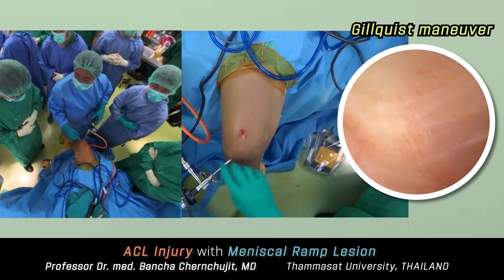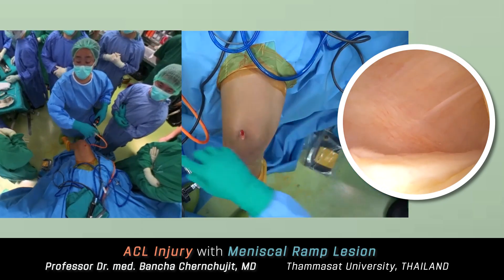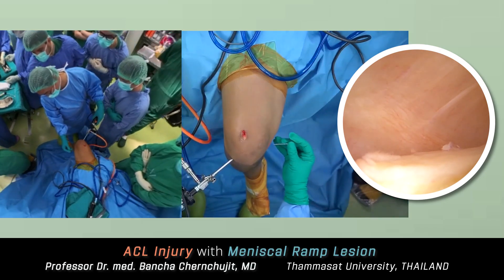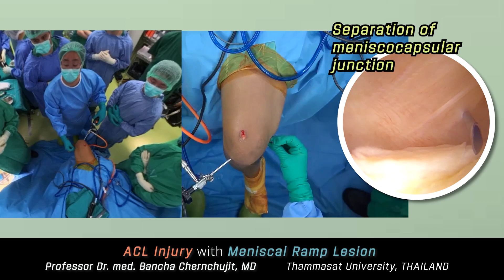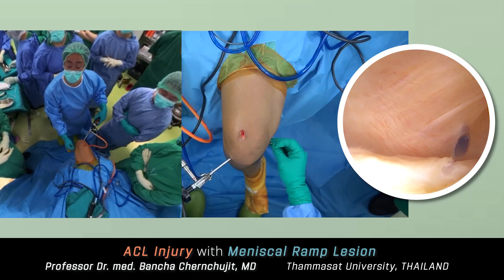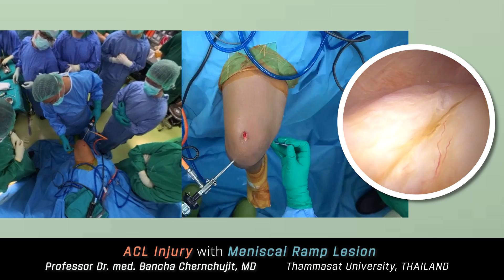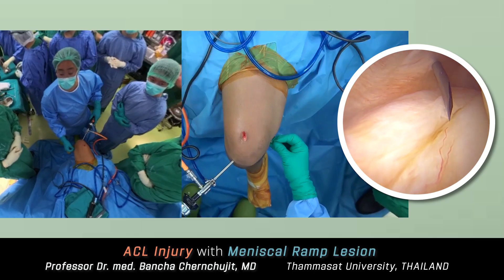With the camera now in the back of the joint, I can see what I believe is a ramp lesion — there's a crack of the meniscus. We need to probe. I inserted a needle at the landmark for the posterior medial portal, always checking the transillumination of the saphenous vein to prevent damage to the saphenous nerve. From the 30-degree lens you can't see it well, so I switched to the 70-degree lens, which gives a better view of the ramp lesion — a separation of the meniscal capsular junction. I plan to place a single stitch here and will come back to address it later.